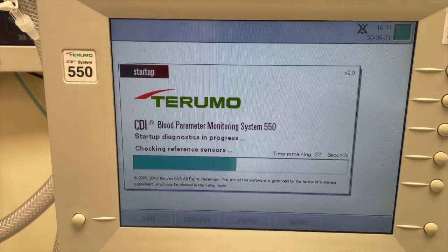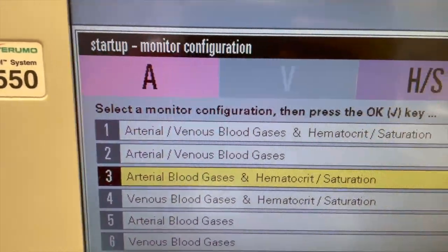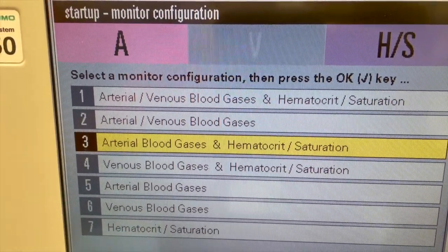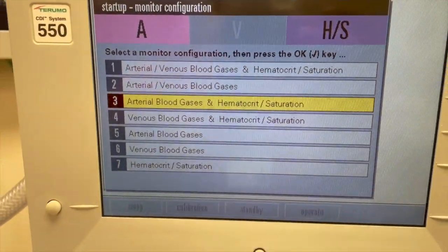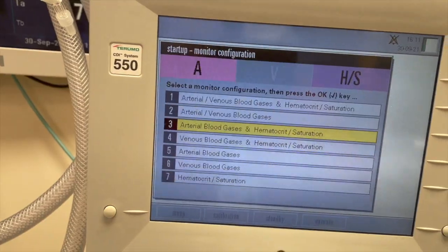The system diagnostic testing takes around 40 seconds to complete. When the monitor configuration screen appears, you can select the configuration of your choice. After you have successfully selected the appropriate configuration, the monitor automatically goes into standby mode.